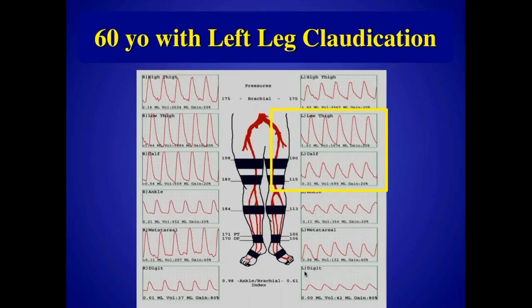And for those patients with claudication, we may challenge them with a treadmill exercise test before and after we take their pressures to see if there's evidence of underlying disease. So we use these indirect or physiologic tests for screening and also to demonstrate the level of disease if we want to focus on a particular area of abnormality.